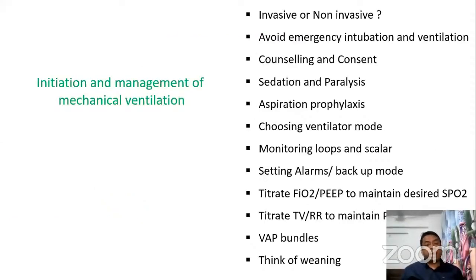While initiating mechanical ventilation, we should think of invasive or non-invasive ventilation. We can try non-invasive ventilation, but we should not try it for a long time. Whenever the patient's condition does not improve within an hour or so, we should not hesitate to intubate the patient. We should avoid emergency intubation.